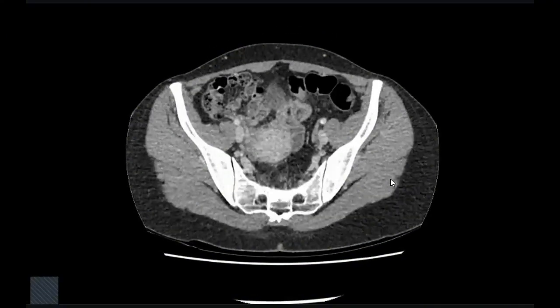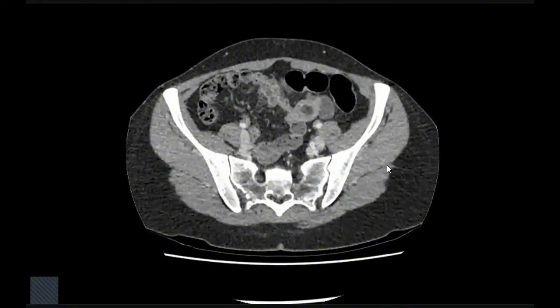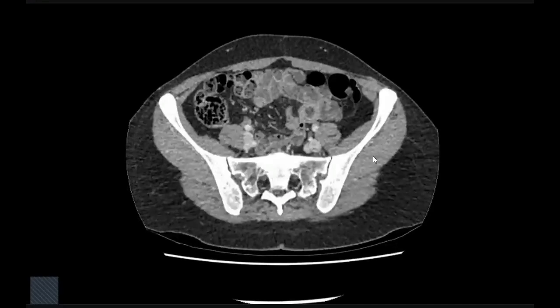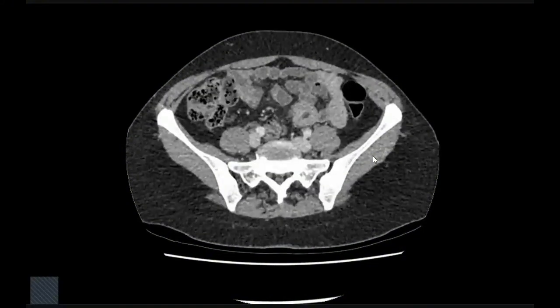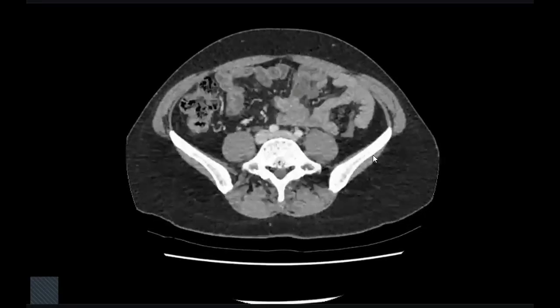I told you again, the patient is 45, complaining of 2 days of vague abdominal pain. You may not listen well to the history. The problem then is that I suspected the abnormality in the first scroll, but I thought it was maybe intussusception. How will the examiner know that you got the abnormality? If you saw anything, tell the examiner, I am suspicious about this region.